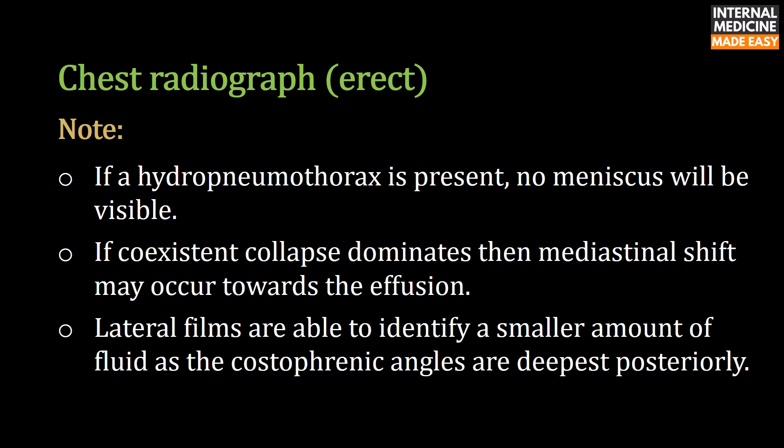Note that if a hydropneumothorax is present, no meniscus will be visible. If co-existent collapse dominates, mediastinal shift may occur towards the effusion. Lateral films are able to identify a smaller amount of fluid, as the costophrenic angles are deepest posteriorly.